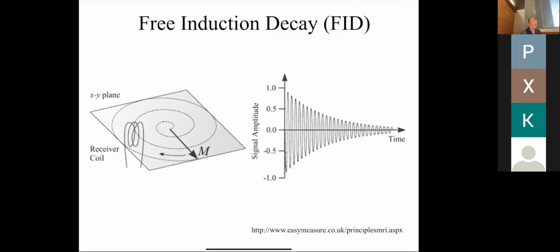So that's called the free induction decay. This is sort of what I just described with my hands. The receiver coils here, picking up this time-varying magnetic field, which induces an E field in here, that's what we essentially measure, okay? So the measurement device in MRI are just simple coils, okay? We don't need anything more fancy than just a loop of wire, okay?